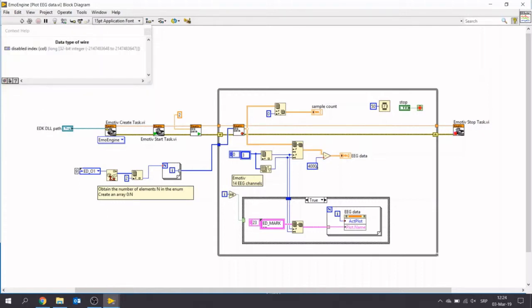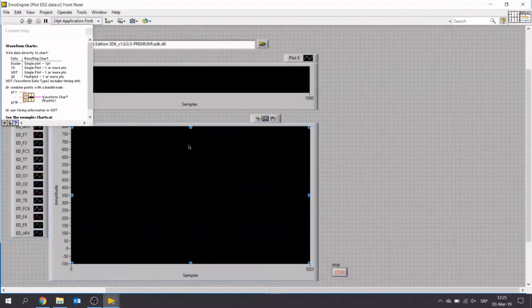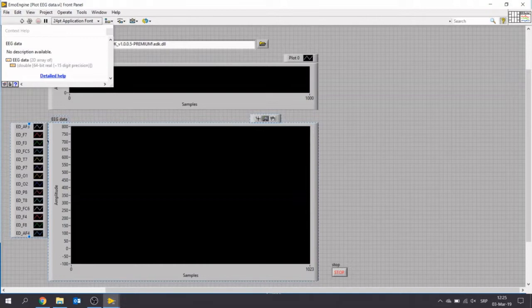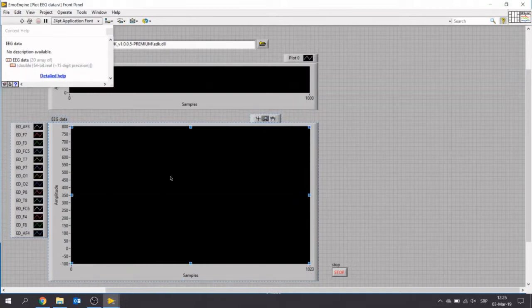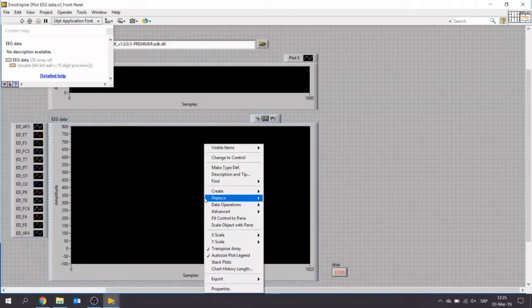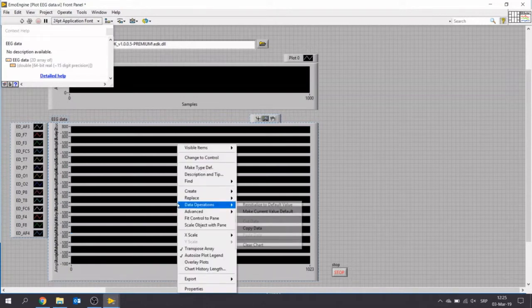We subtract this constant of 4000 and save that data in this EEG data graph, to show that data. So we have a chart that has all 14 electrodes that are placed here. We can show the data all in one graph, or we can divide this into different ones. So we are going to say stack plots, and it's going to divide this into 14 smaller graphs.